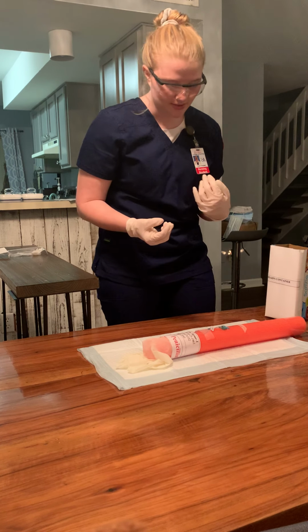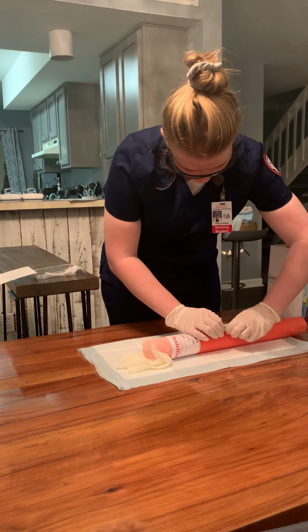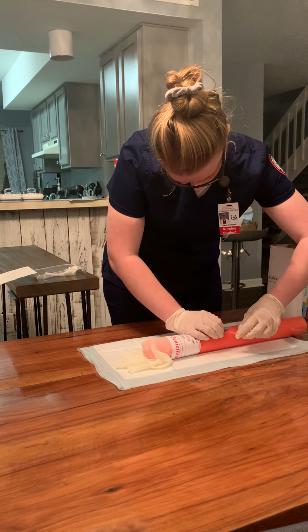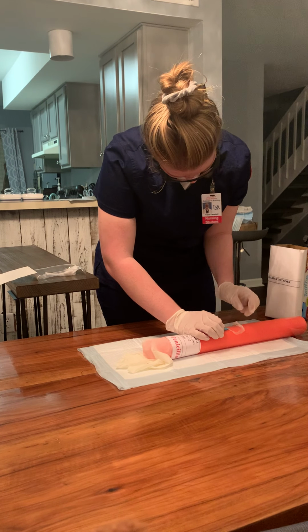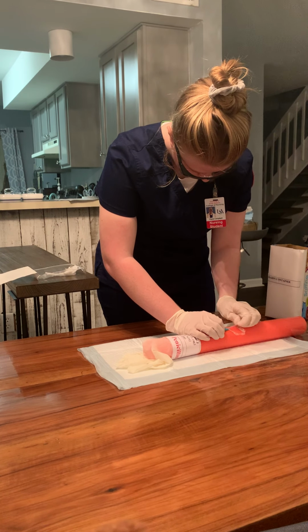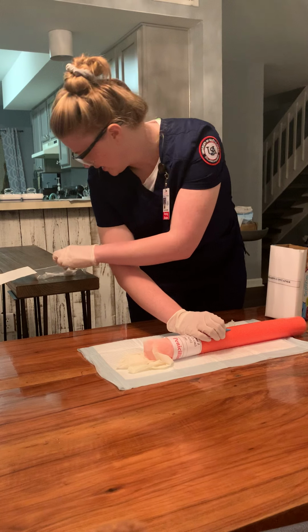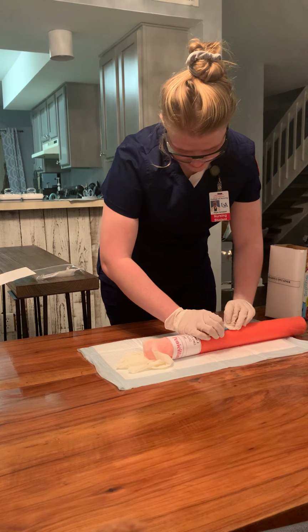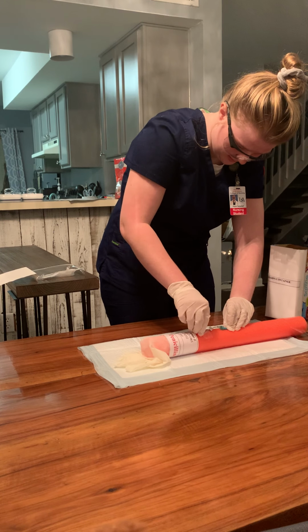go, and I'm going to start just by removing the transparent dressing towards the insertion site, making sure to stabilize the catheter. And I'm just going to set that there, and then I'm going to take a folded piece of gauze and place it right above the insertion. Remove my tape on the saline lock.